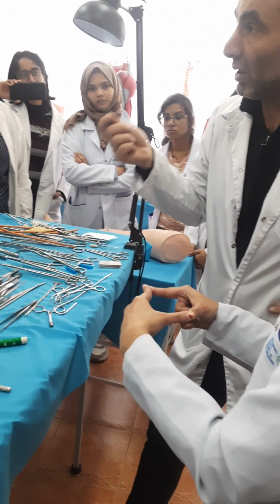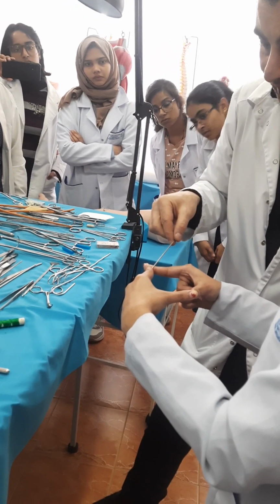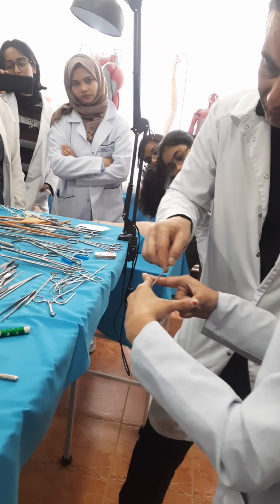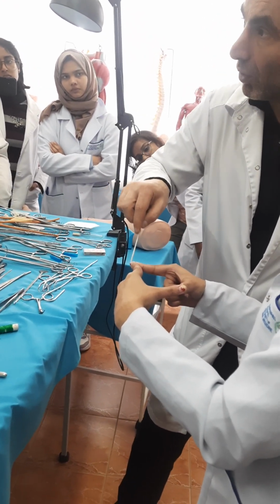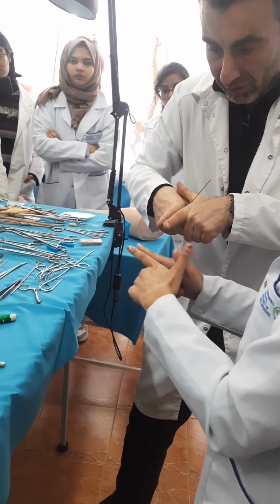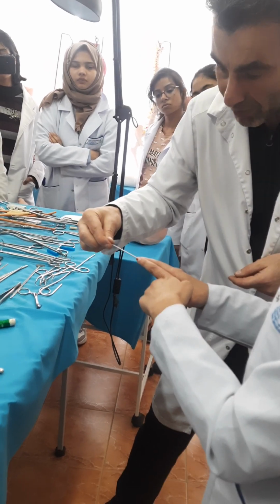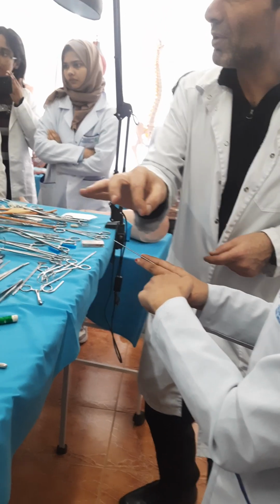That's why we can make a unique type of suture, which we call intracutaneous suture. We pass the needle from the margins of the wound and don't perforate the skin from outside. Then after, can you connect it now? Yeah. Then after I close this suture line, the thread will be between the margins. Invisible suture. No piercing points.